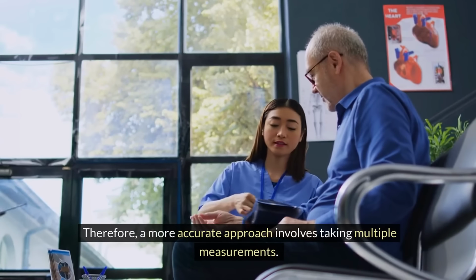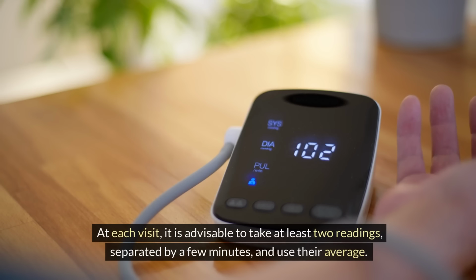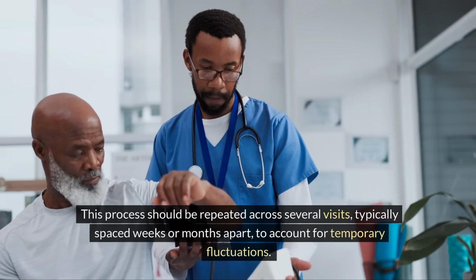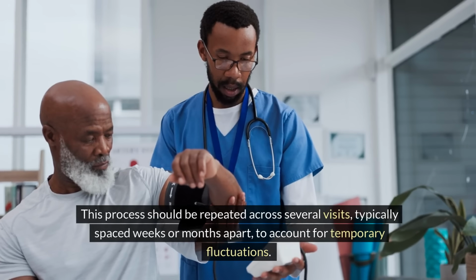Therefore, a more accurate approach involves taking multiple measurements. At each visit, it is advisable to take at least 2 readings separated by a few minutes and use their average. This process should be repeated across several visits, typically spaced weeks or months apart, to account for temporary fluctuations.